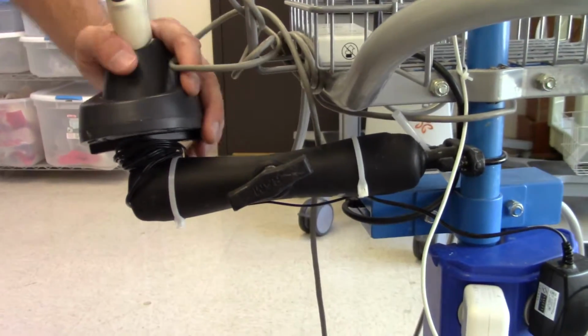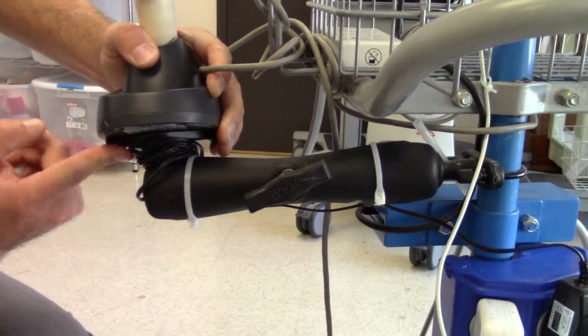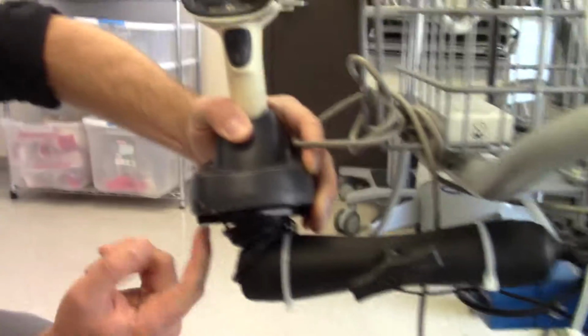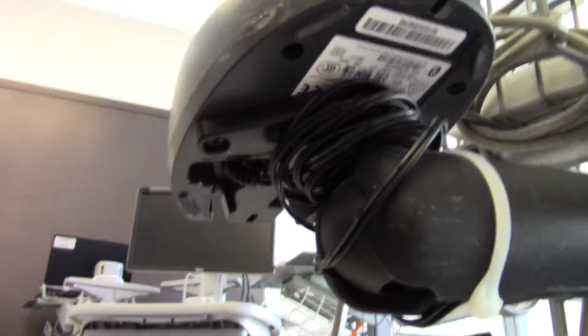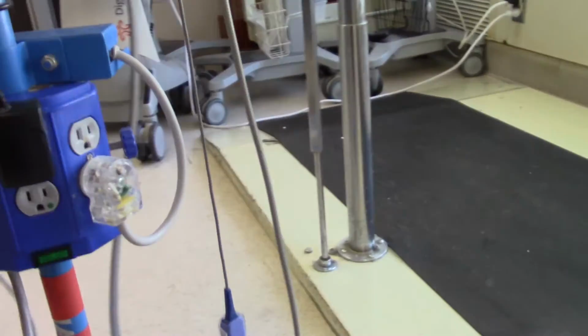Company. And you can see on the base of the scanner here, there's also this little ball end that attaches to a spacer that fits the 1902 mount. Oh, I see. And where will you let us know where you get that spacer? Yeah, it's RAM mounts. Everything's RAM mounts for all the mounting.